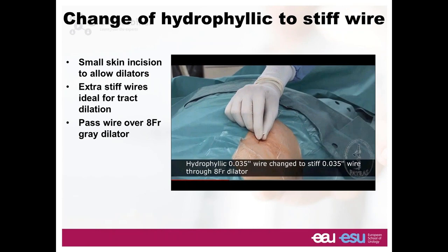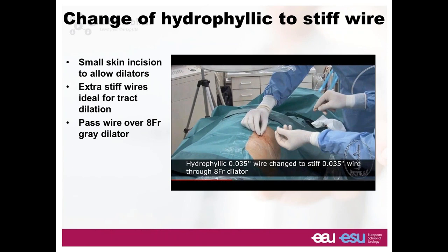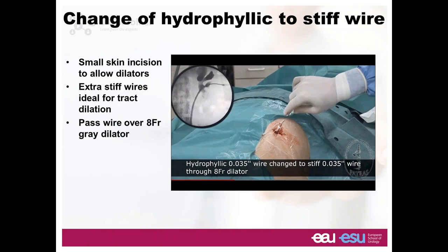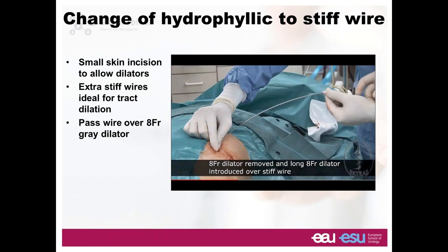You see that the dilator is going down the ureter. You pull out your wire and exchange it with a nice stiff wire — the stiffest you can find. The one I favour is the Lunderquist, which is very stiff. Make sure to always insert the floppy part of the wire inside; if you insert the stiff part, it's like a knife. You insert the wire down the ureter because the catheter is down the ureter. You extract the dilator and then the next step is you start your dilation.